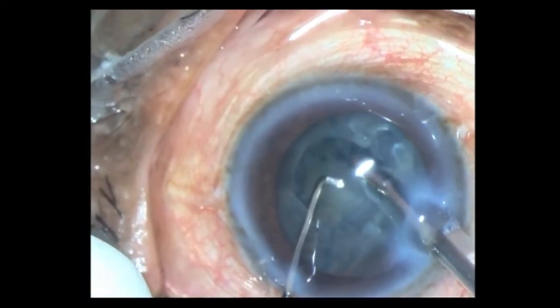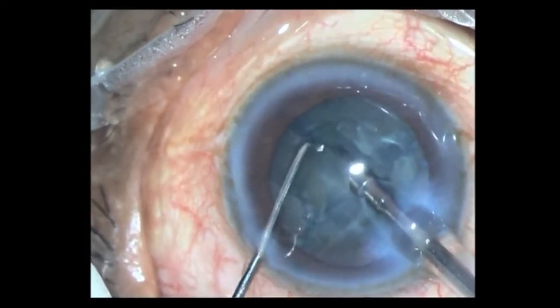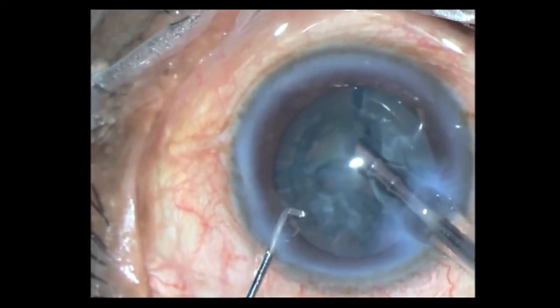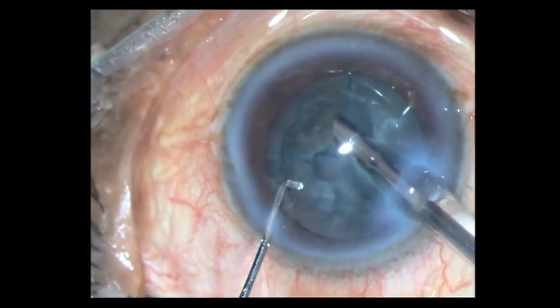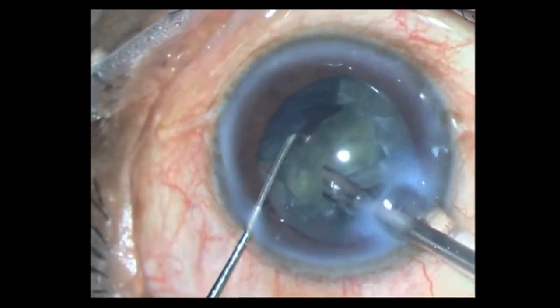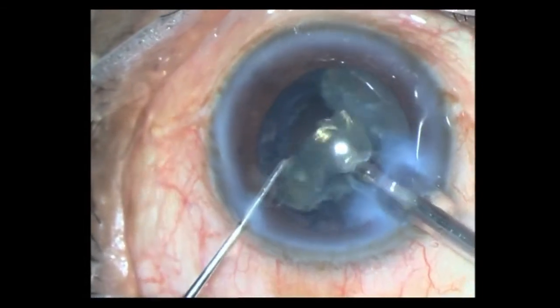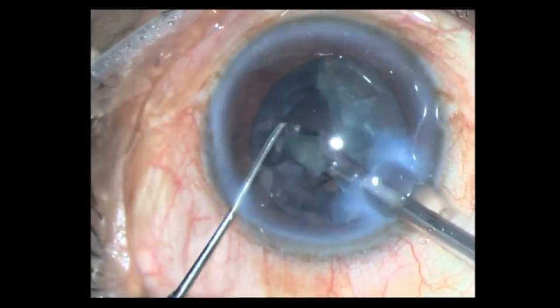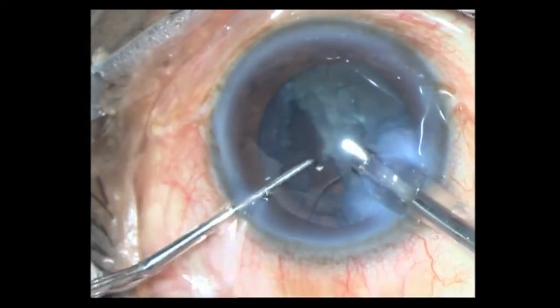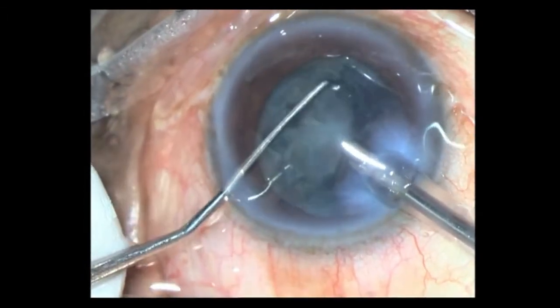Once that's done, it's time to take out the segments. At this point I am at 400mm vacuum, 40ml flow rate, the same phaco power around 50% preset value, and I am in pulse mode at around 40Hz. I proceed to take out these segments.